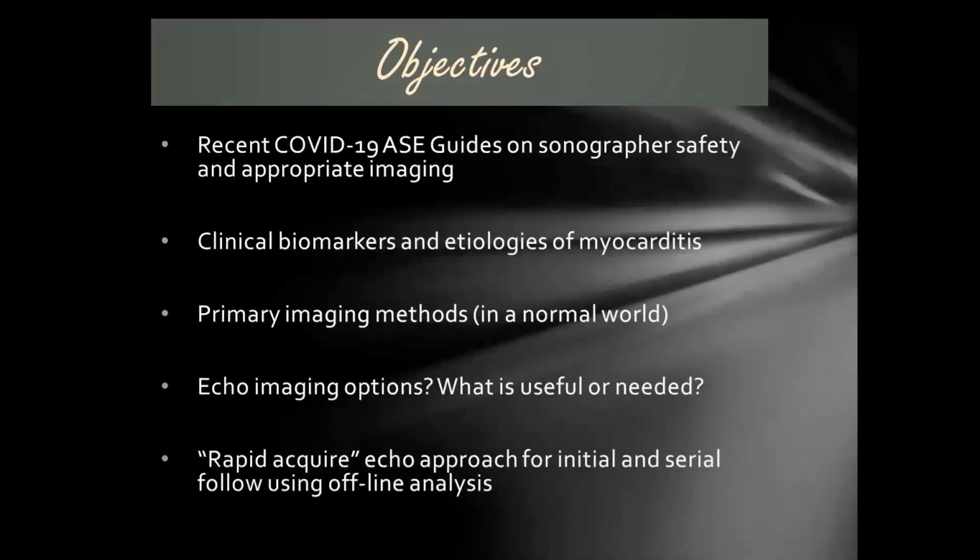So what are the objectives for this? First, I just want to make a note of probably the most important thing that's come out recently in echo, which would be the recent COVID-19 ASE safety guides. And I'll point you in the right direction for that for anyone viewing who may not have already interacted with that information. Then we'll just talk about myocarditis in a normal world. Now it's a little different with this virus, but we'll talk about it as a global subject matter.